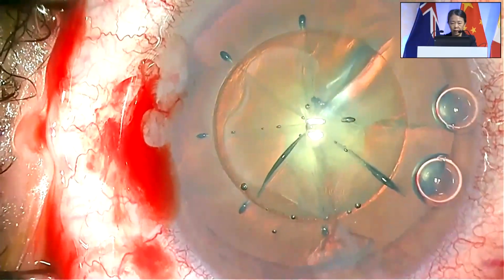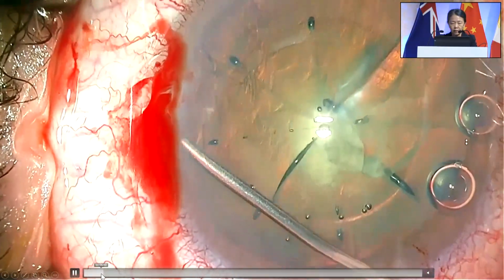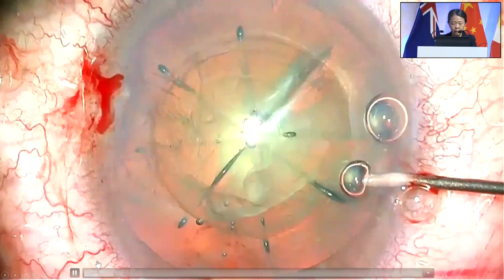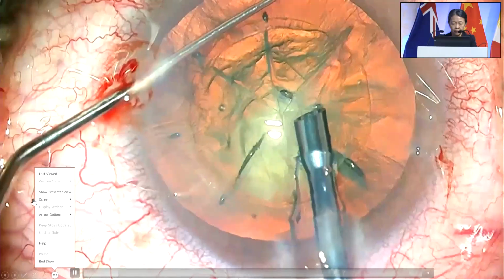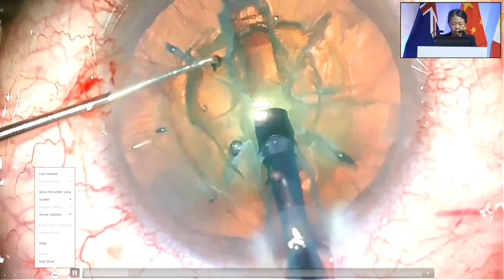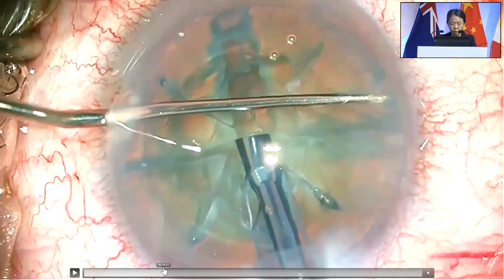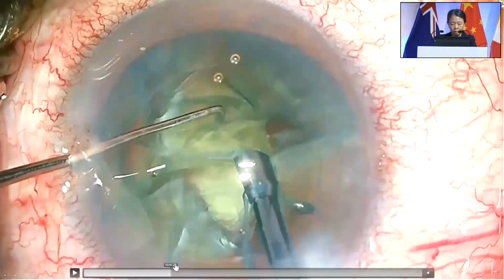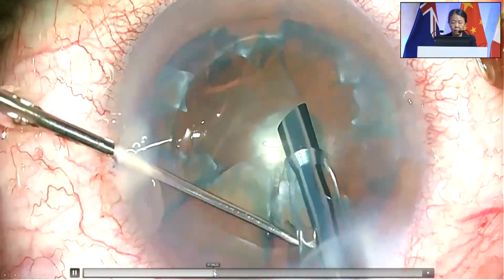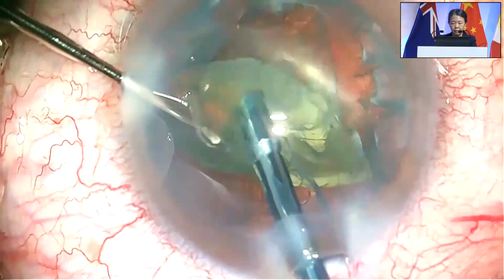So I'm just going to fast forward through this, because it's just how I do a polar cataract that's already pre-ruptured, putting some viscoelastic there under the anterior capsule, and then doing the phaco in my standard polar cataract technique. Okay, I'm going to just fast forward through this. So I just do a cross chop, and then towards the end, we have this epinuclear plate that's still intact over the polar opacity to protect the defect.